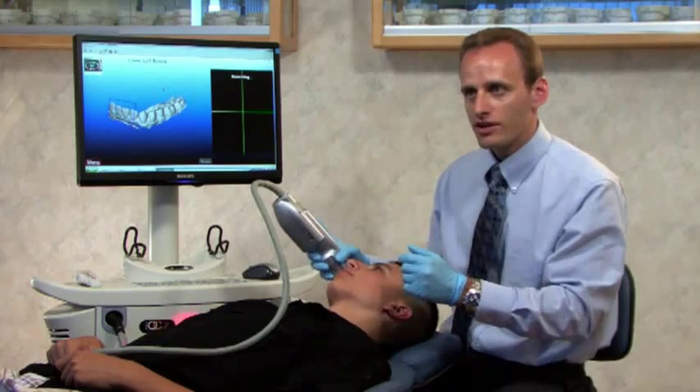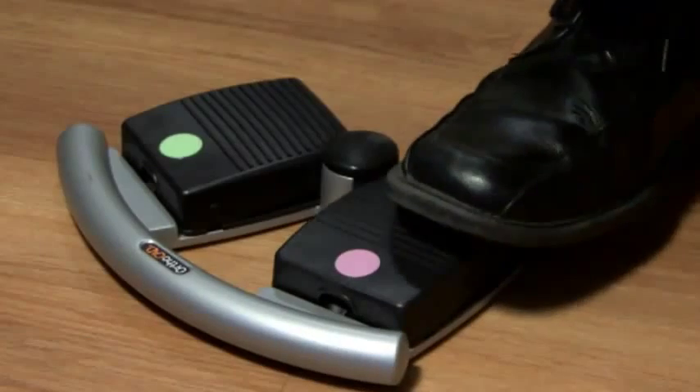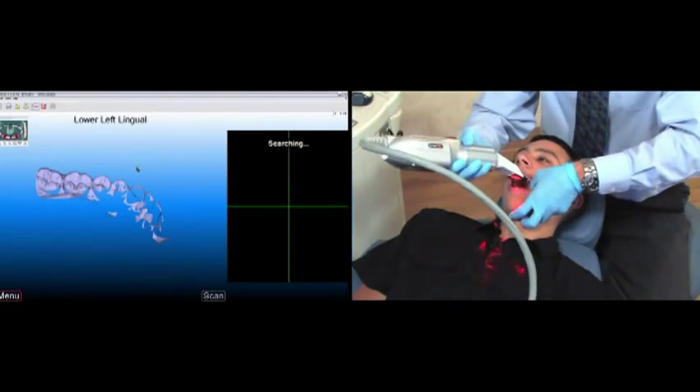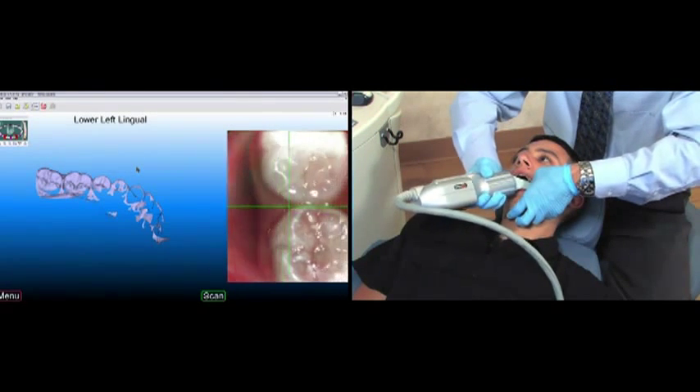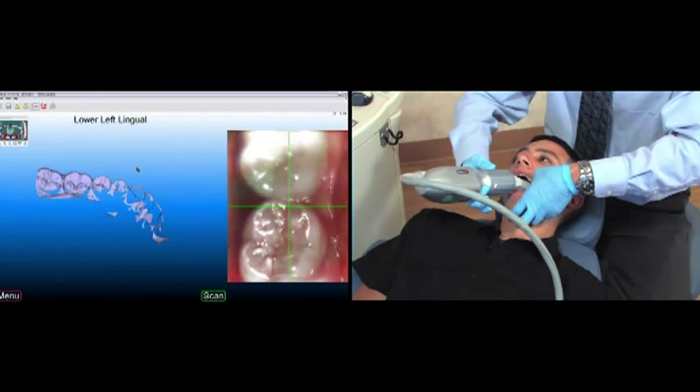So far things look good, so I'll continue by pressing the pink foot pedal, then pressing green to move to the next segment. I'll begin at the same spot — the second molar — this time from the lingual view.